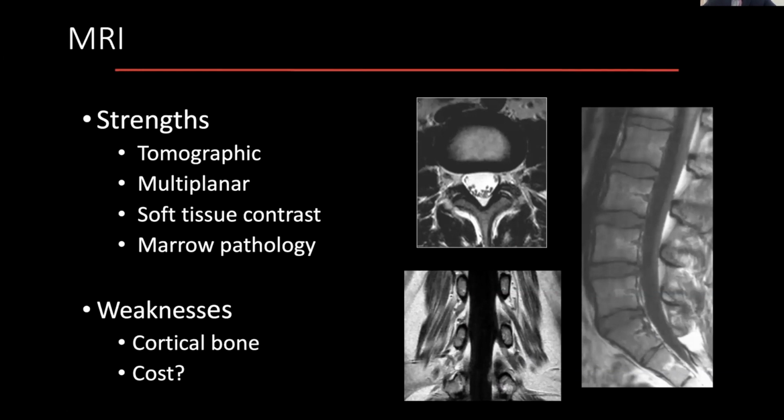MRI, again, the strengths are mostly around its ability to differentiate different types of contrast. We have different types of sequences. Again, I think you guys will be aware. You may have seen the terms T1, T2, STIR, FLAIR, etc.